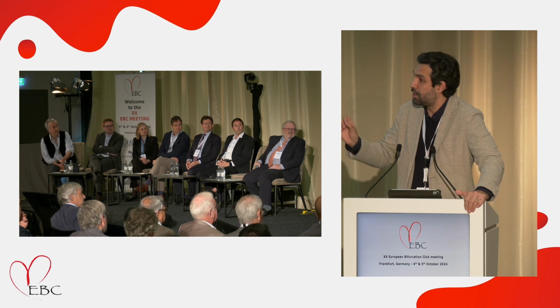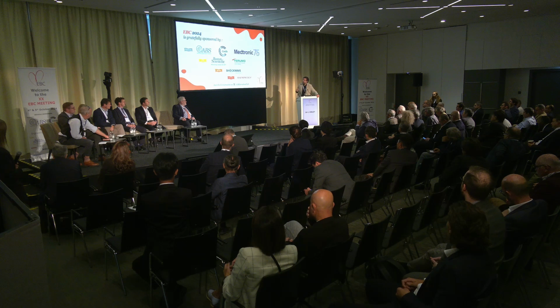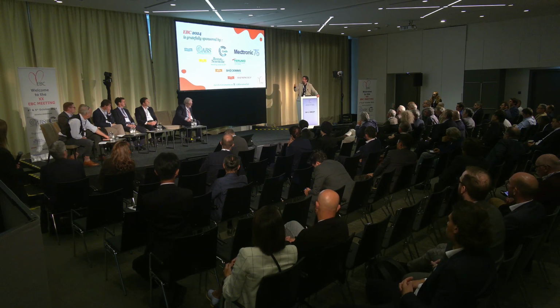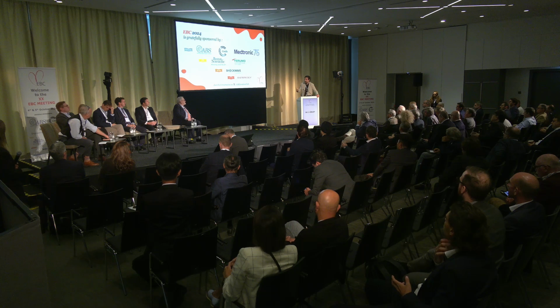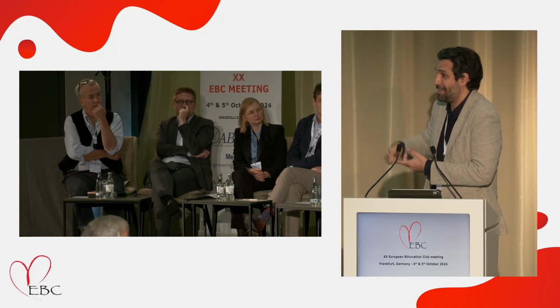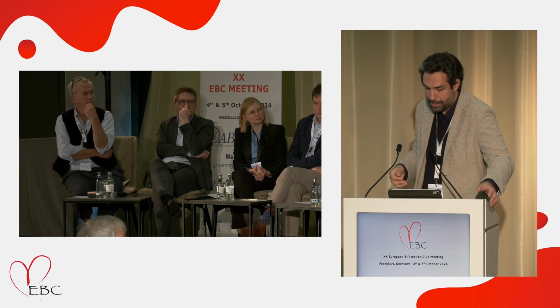I have to say that the first reconstruction that I showed, called 3D MIP, is perhaps the most important projection for you because, one, you will understand it very quickly. Second, it will tell you how complex the disease is. Based on that picture, you not only know how complex the PCI is going to be, but you will change the size of the guiding catheter, even the access site. So you will really understand the complexity that you're stepping into.